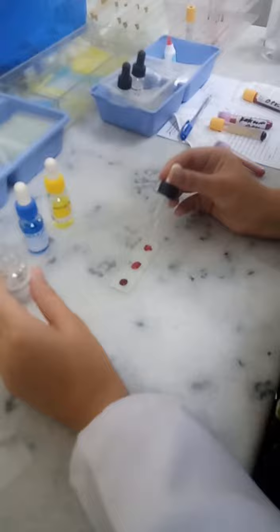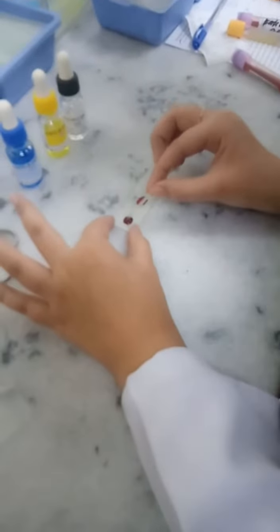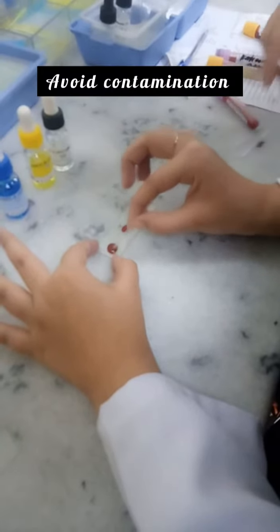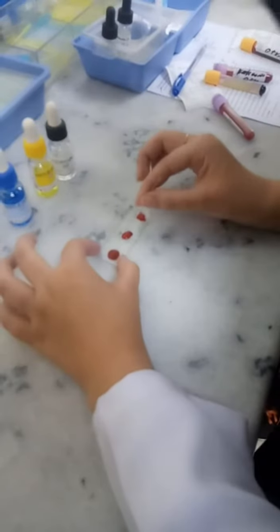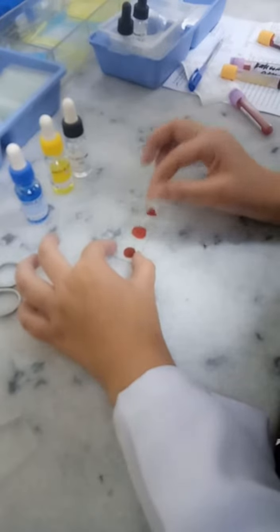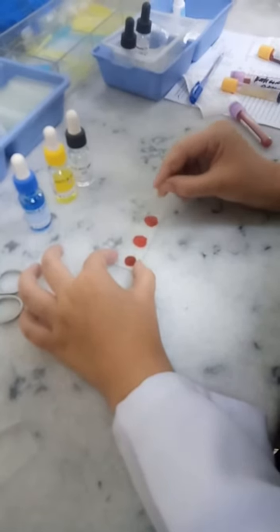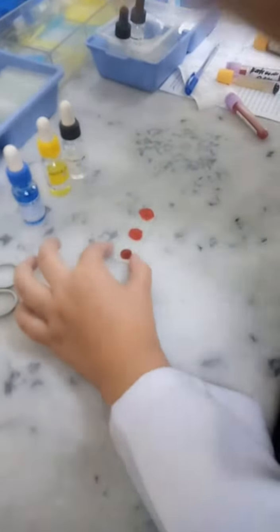Now take out the stick and mix the first blood drop, which is A. Remember, do not use the same stick for mixing the second blood drop to avoid contamination. Use the second stick for mixing the second blood, which is B. And now use the third stick for mixing the third one, which is D. We have mixed it and now we will take it up.